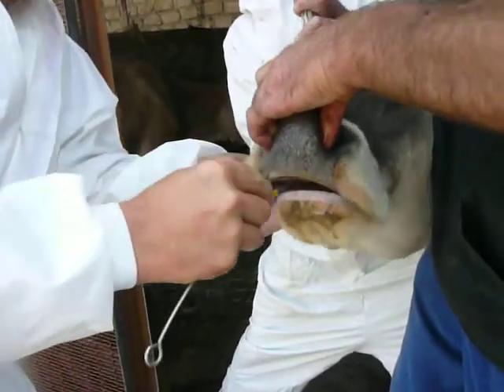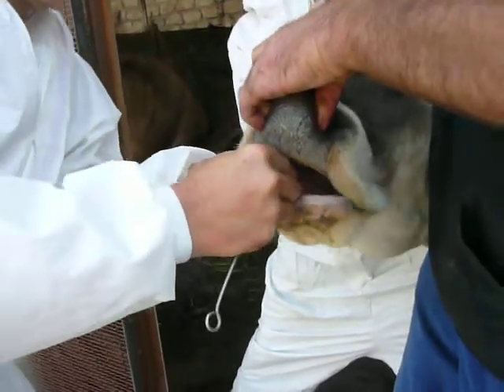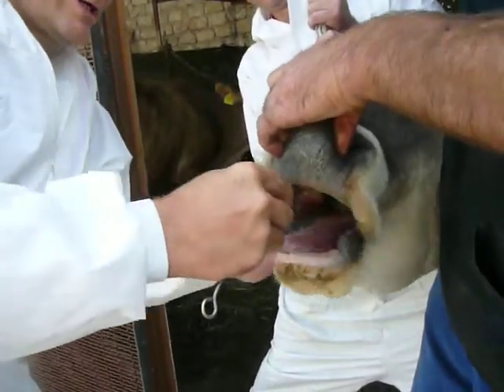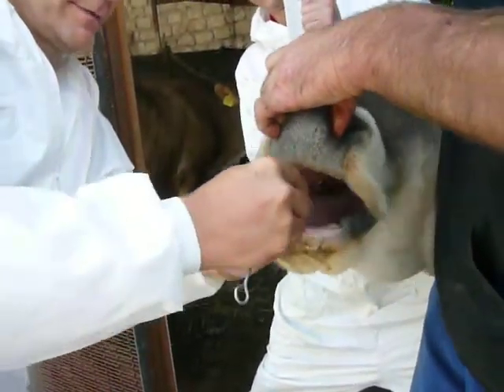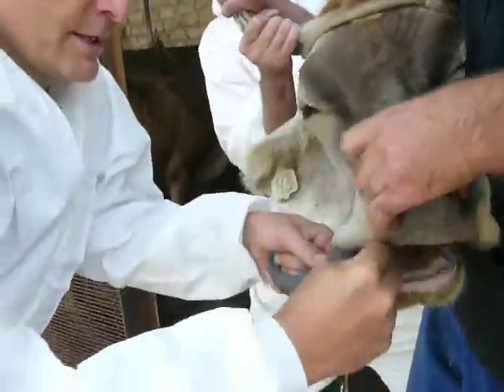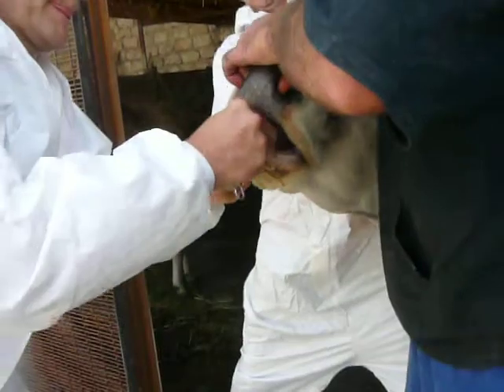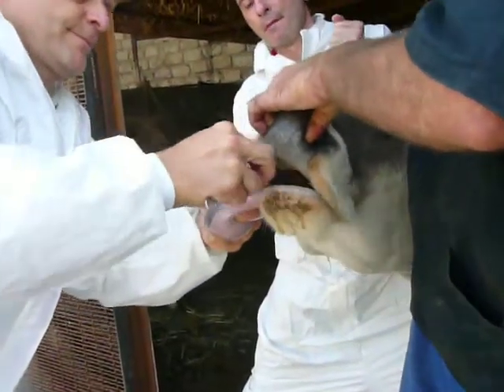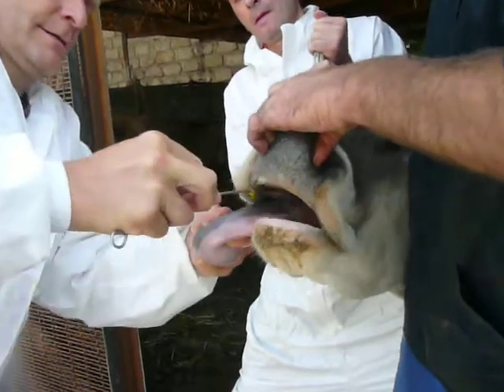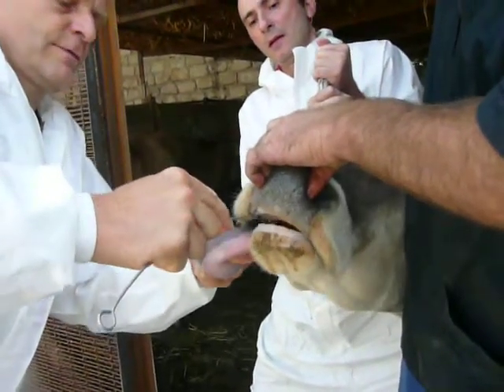And then scratch — move forward about five to ten times to get material from the whole region, from the soft palate, from the whole Oro-Pharyngeal region. Then scratch and move it out again.